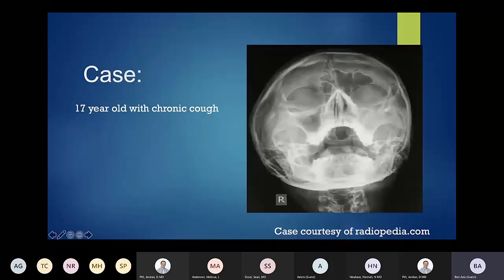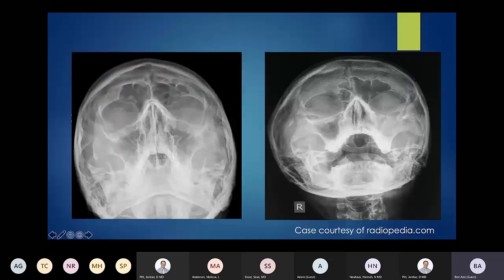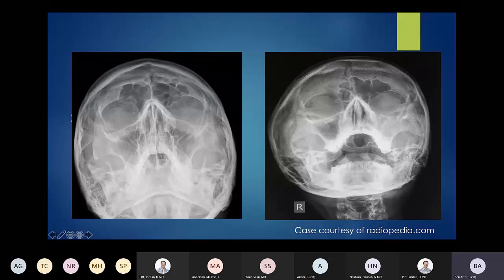Next case: a 17-year-old with chronic cough. The Waters view gives us a good look at the frontal and maxillary sinuses. The left maxillary sinus is a little more opacified than the right. The bilateral frontal sinuses look pretty decent, but comparing to a normal Waters view — where bilateral frontal sinuses are open and bilateral maxillary sinuses are symmetrically aerated — you can see the left is almost completely opacified compared to the normal right maxillary sinus.